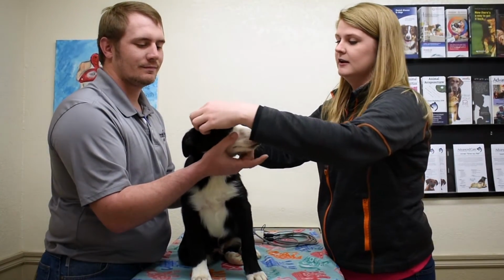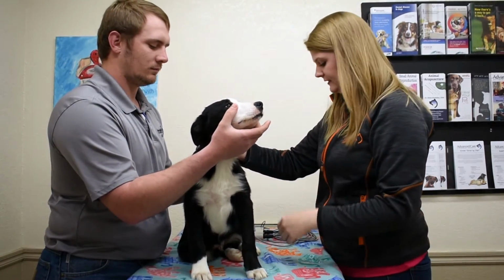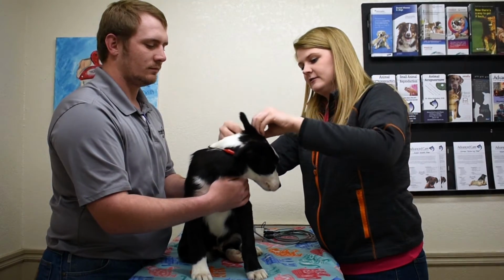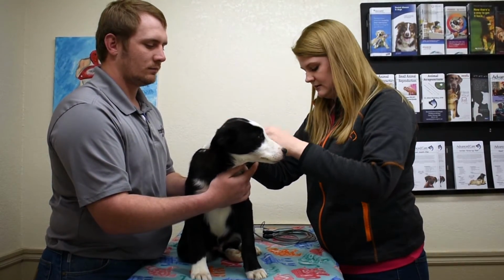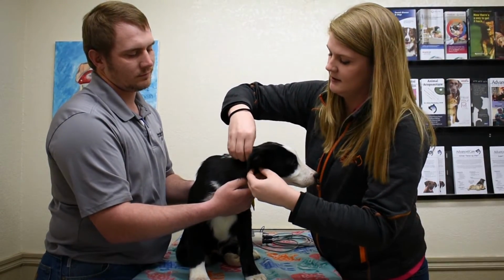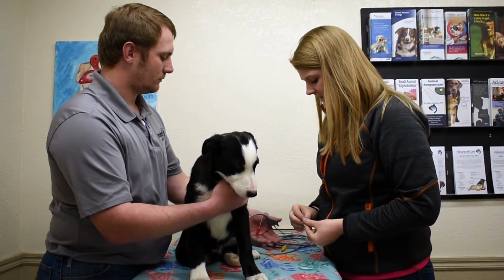After we get done, we'll usually take 2 samples, but for his purposes, we'll just go ahead and take his leads out. Since he's just a demo dog, he doesn't need 2 checks right now. So we'll go ahead and take out these little guys. Hide our little needles in our blanket here. Remove all of our leads. And then he is good to go.